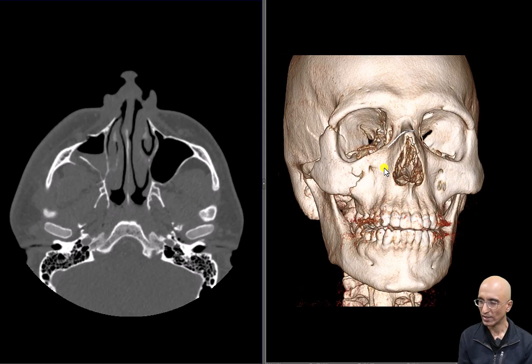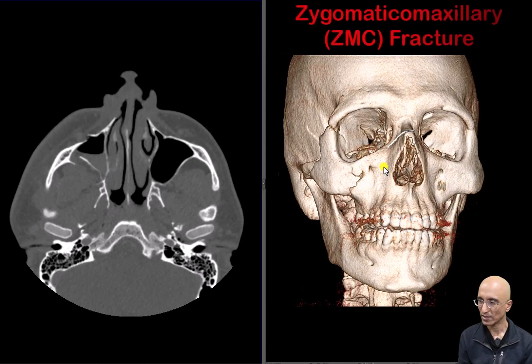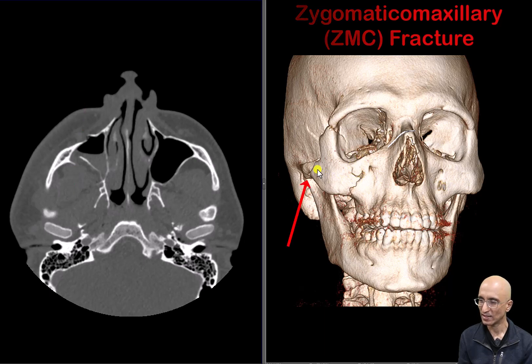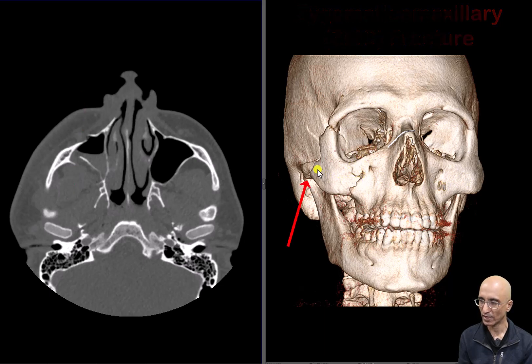The constellation of findings is consistent with a ZMC fracture, which typically has five fracture components: fracture through the lateral orbital wall, fracture through the orbital floor, anterior and posterior wall fractures of the maxillary sinus, and zygomatic arch fracture.